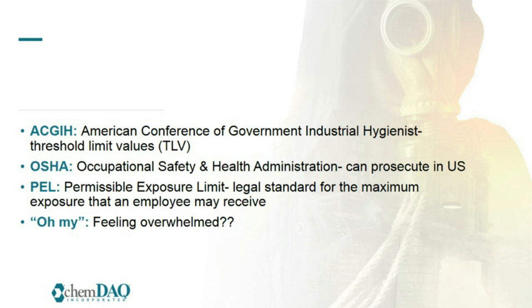For chemicals with no PEL, employers should reference the ACGIH TLVs and the NIOSH recommended exposure limits, as well as the Cal-OSHA PEL limits. OSHA recommends following these other exposure limits if they are at lower concentration levels.